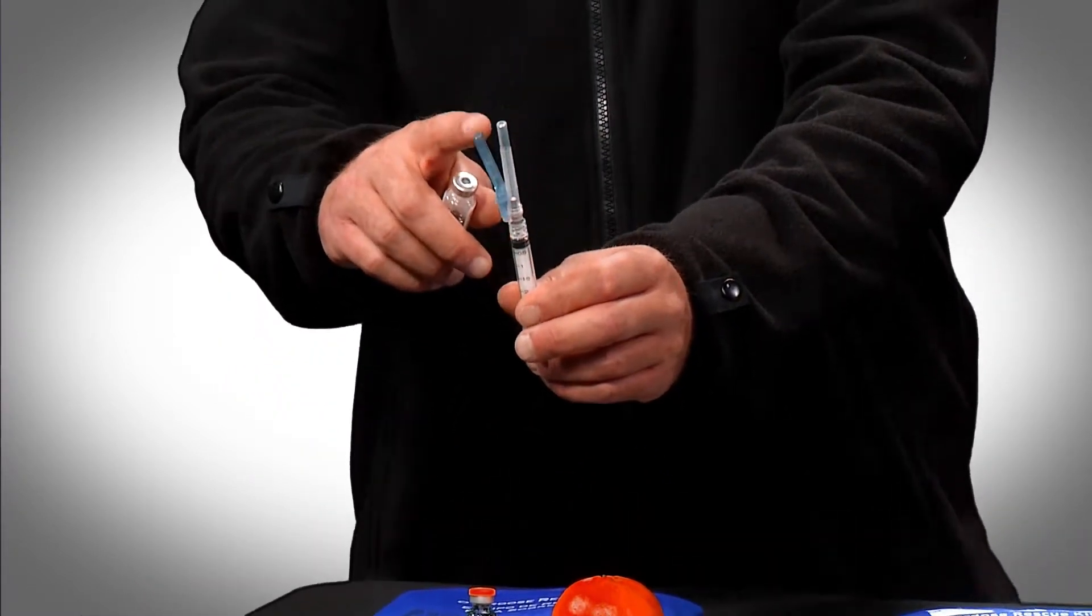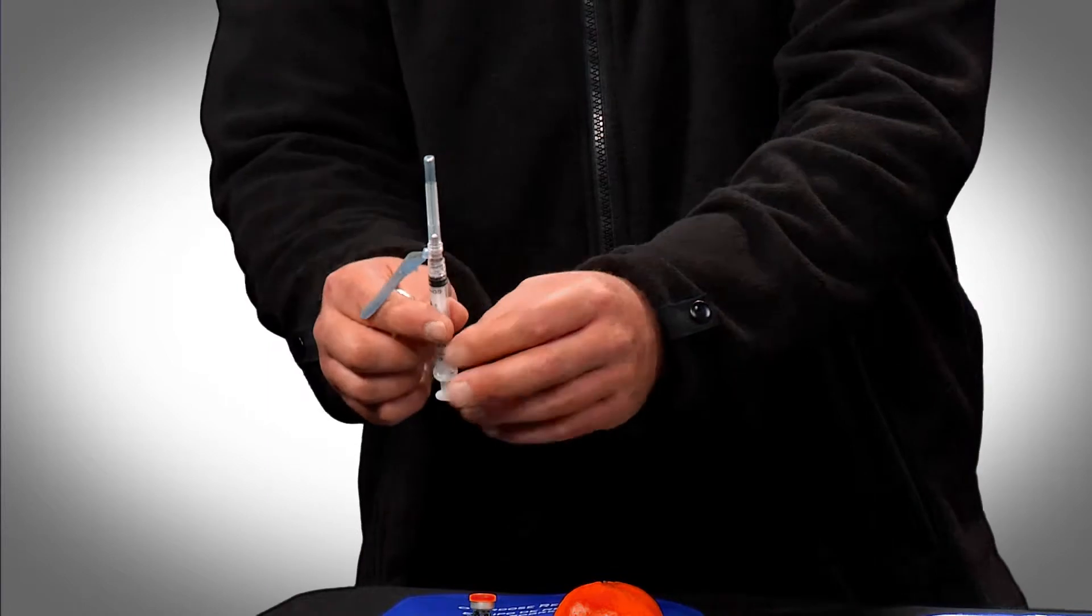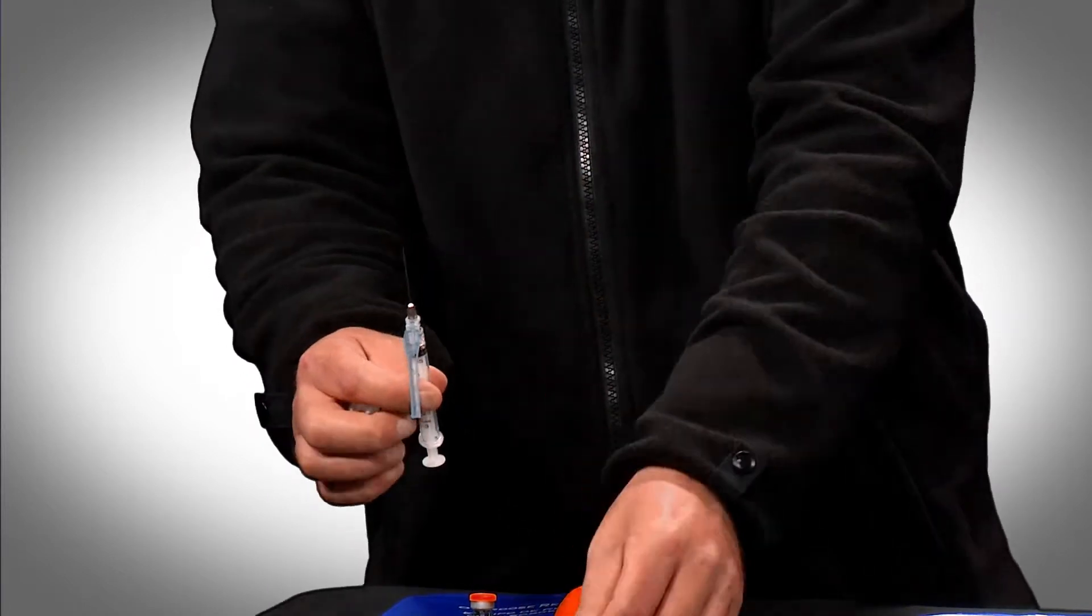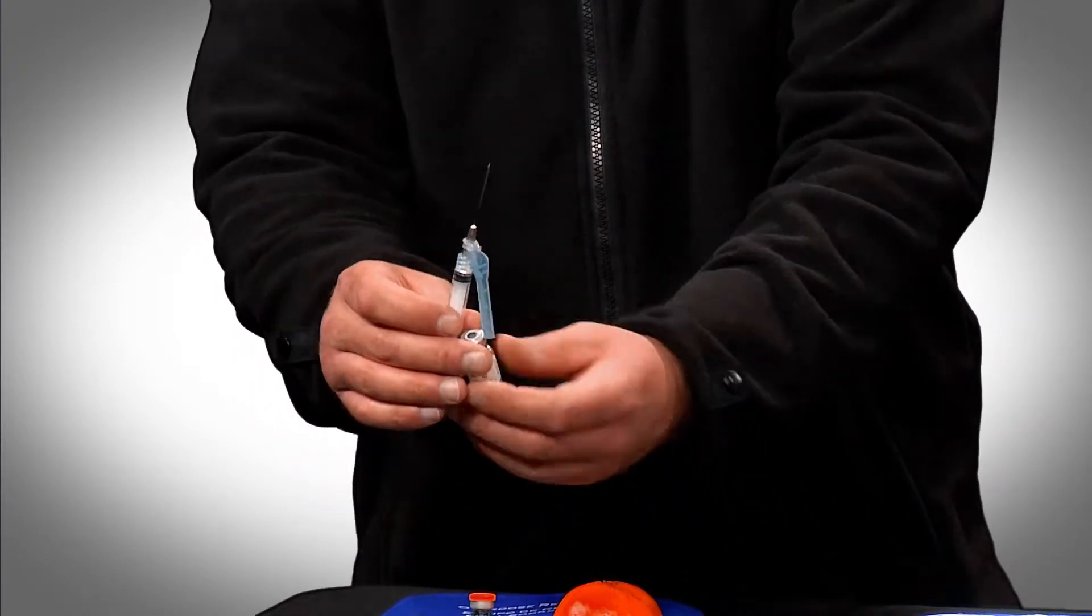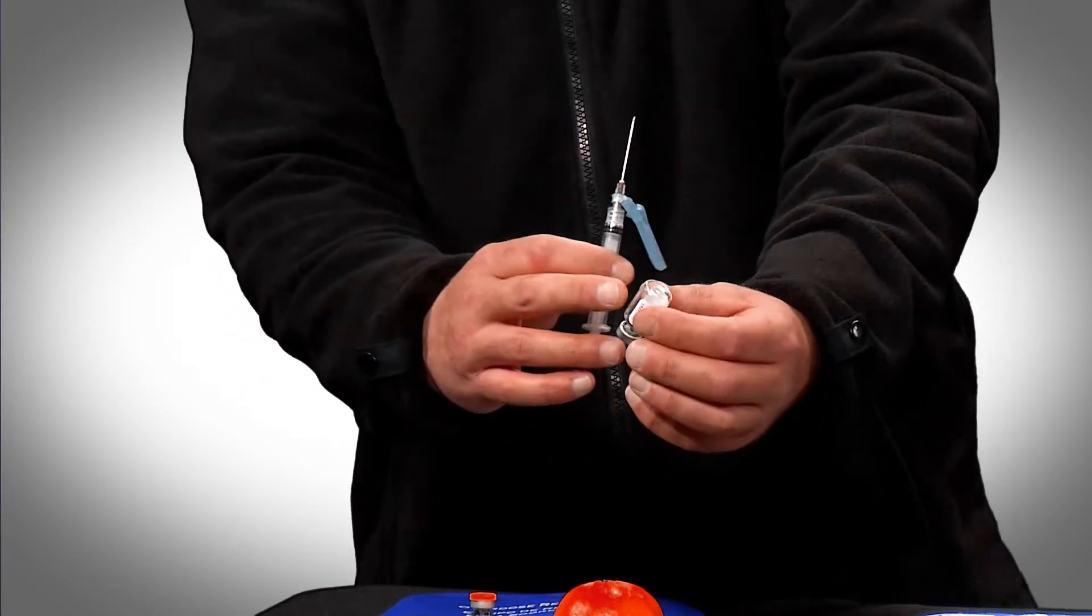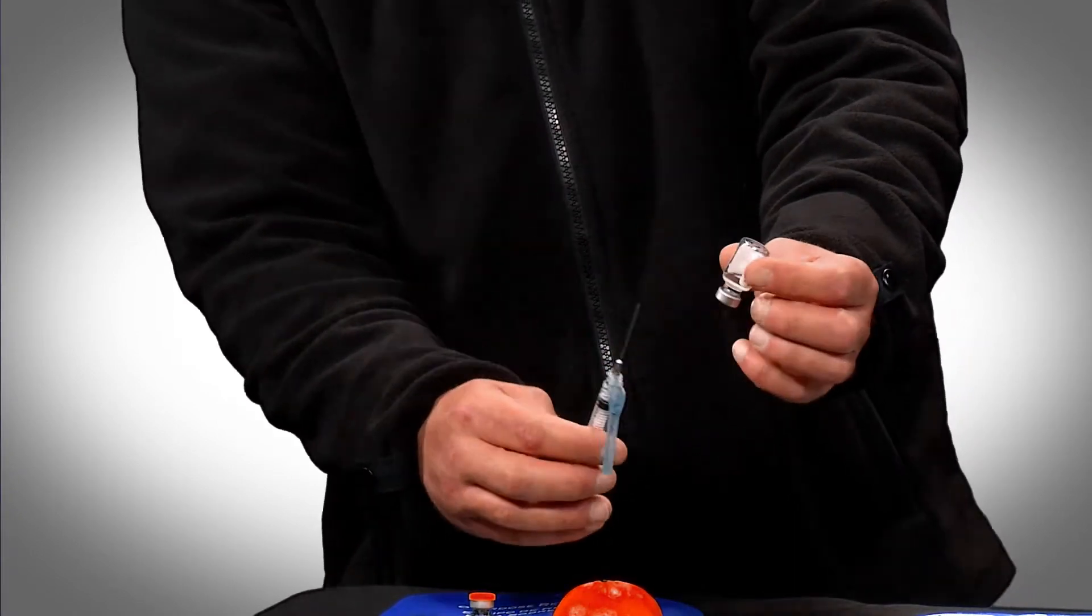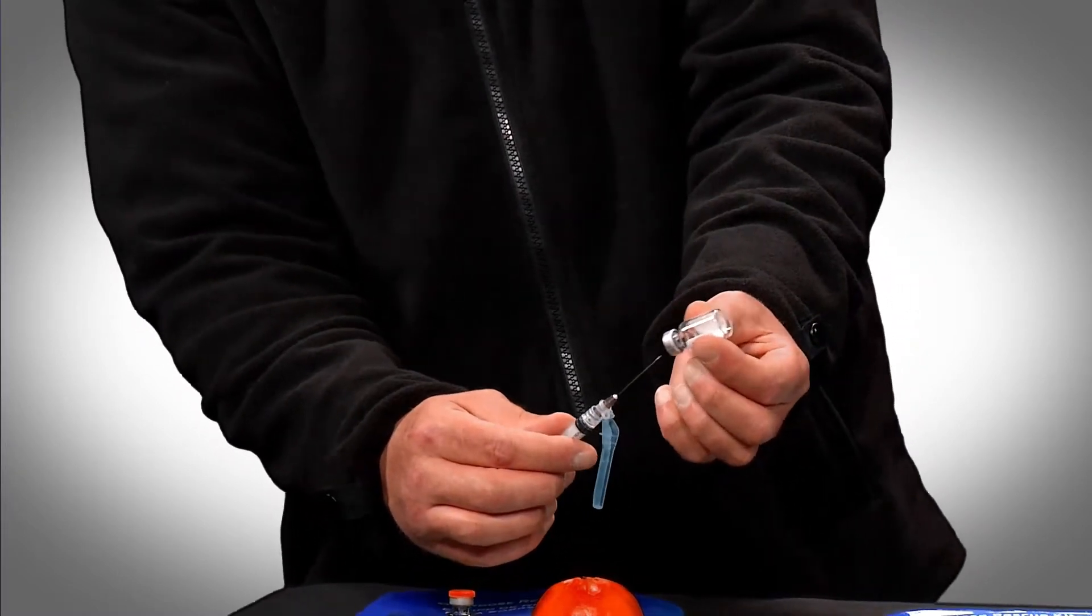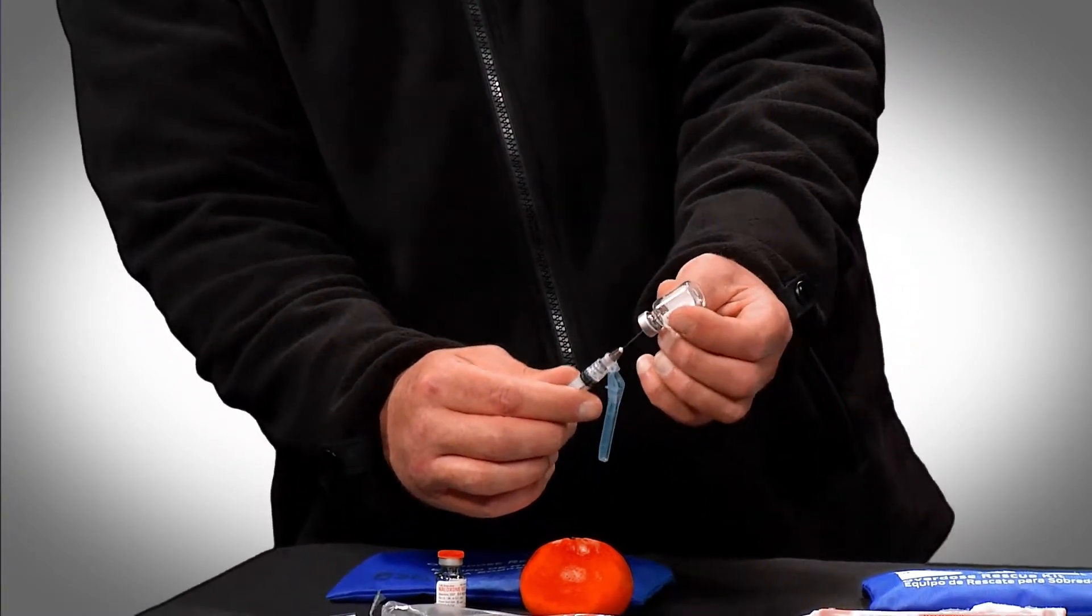Get this green guard out of your way to begin with, then uncap your syringe. Then take your naloxone vial. If you notice, the label doesn't go all the way around. I always tell people to look where the break in the label is so you can see the liquid. Then insert the tip of the syringe through the rubber membrane in the cap of the vial.